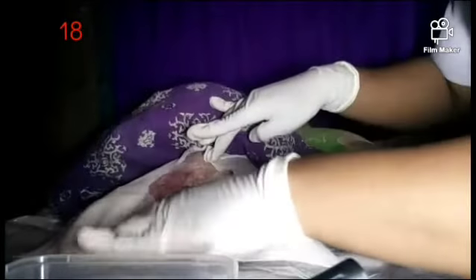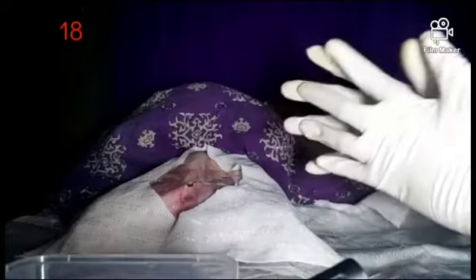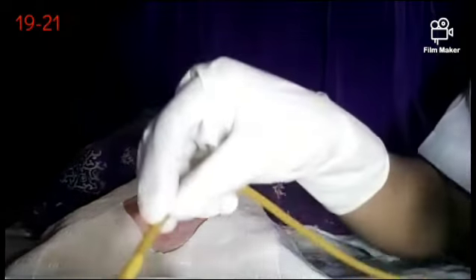Place the fenestrated drape over the vulva area, exposing the labia. Lubricate 1 to 2 inches of the catheter tip and avoid clogging the lumens. The rationale for this is lubrication facilitates the insertion of the catheter and reduces trauma to the tissue.